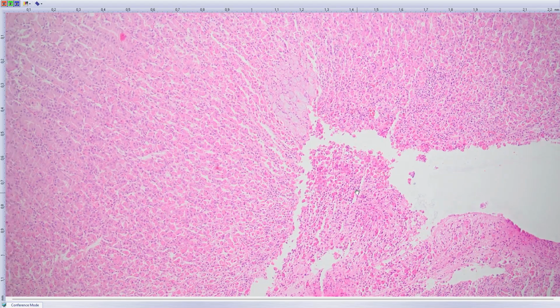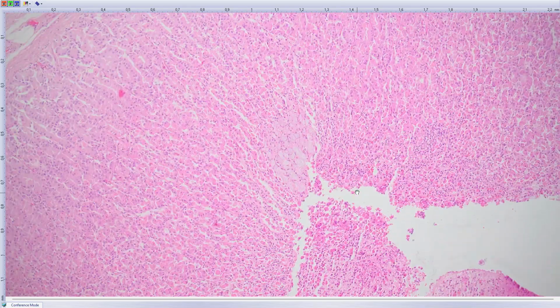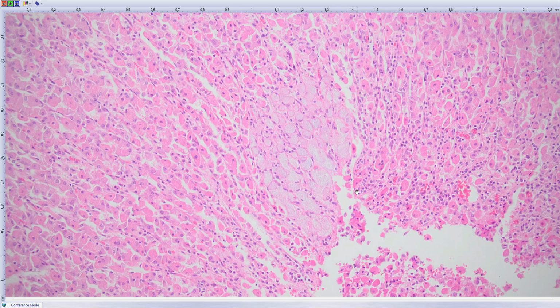In these cases, I have shown a case like this before at this seminar. You should submit the whole stomach. So it was submitted in some 130 something blocks. And this is the only one block with this kind of lesion, and this is, I believe, signet ring cell adenocarcinoma in situ. So it's not invasive.